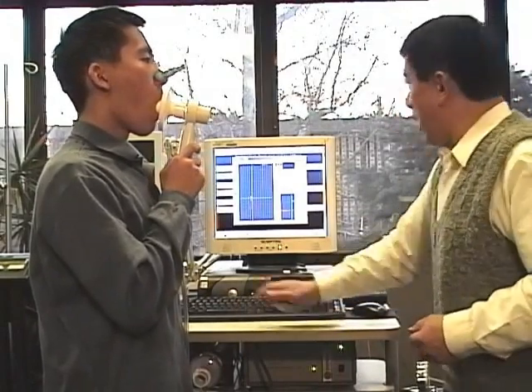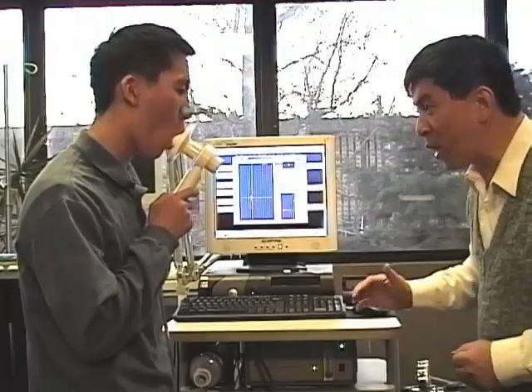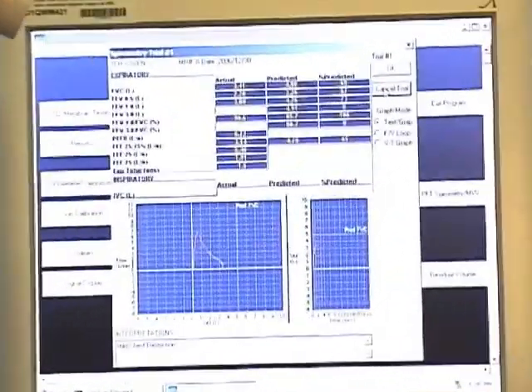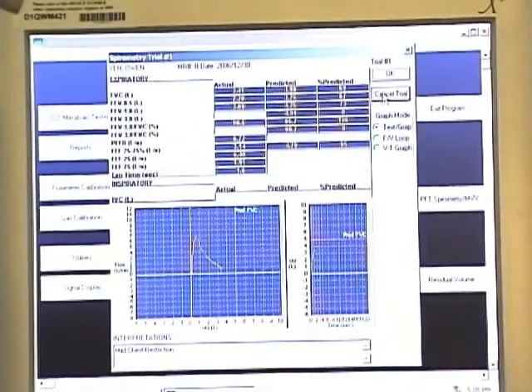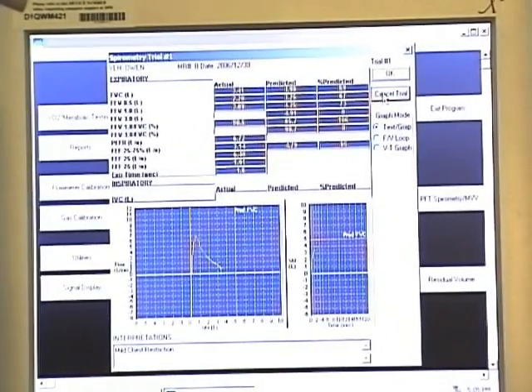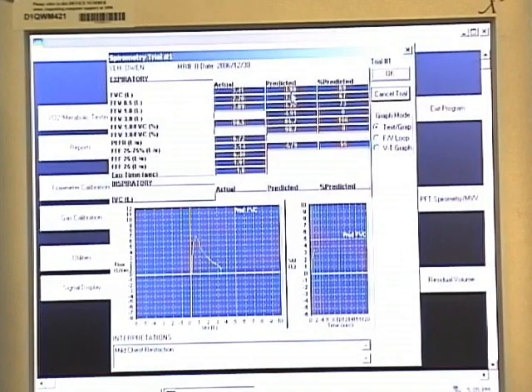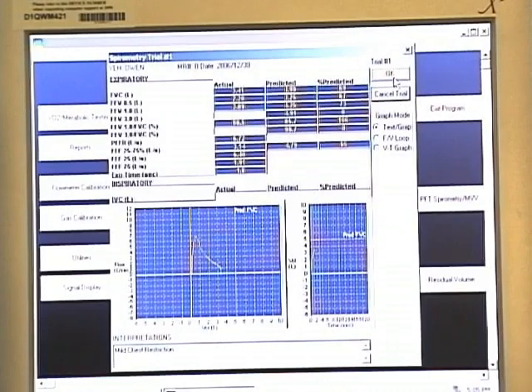Then press the space bar and have the subject exhale as far as they can — keep going. It's a little bit short, only 1.66. The subject probably did not inhale big enough, because according to the prediction they should have five liters in FVC, but this subject has only 3.41. We'll save this one but try the next trial.